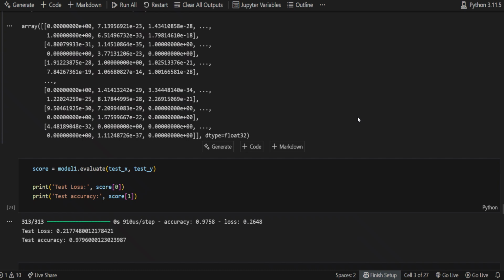So this is the concluding video of ECG training, how we train it, and it is basically on test bed processing. This way we implement and increase the accuracy of the predefined models, and we will use hyperparameter tuning as we have changed everything, and we will get a more accurate and better result in this.